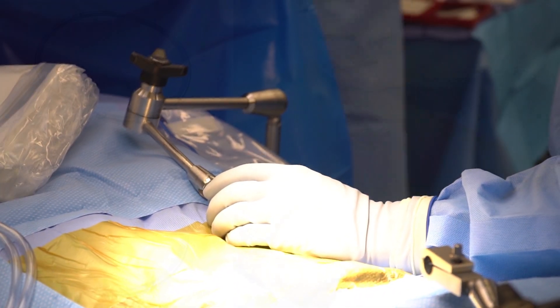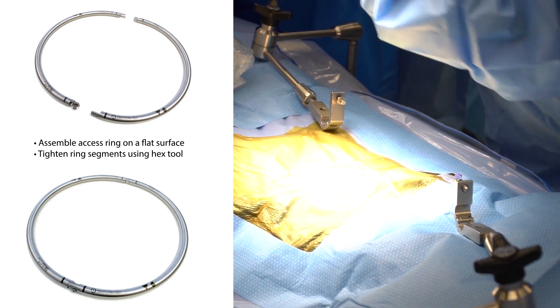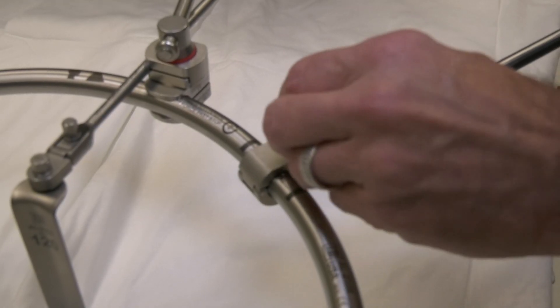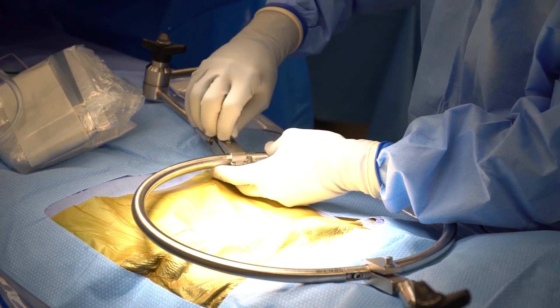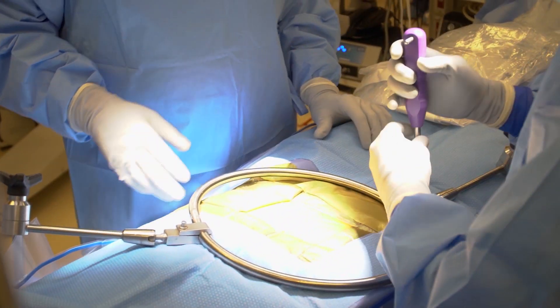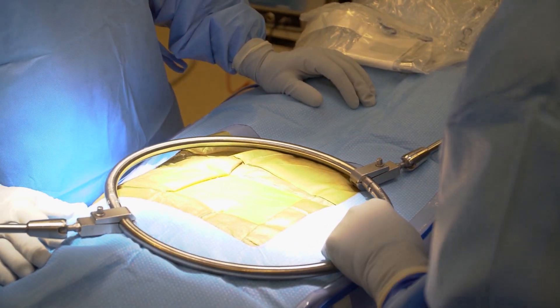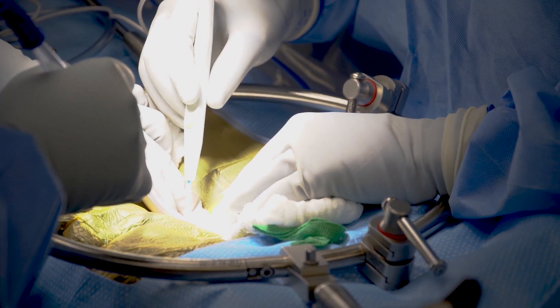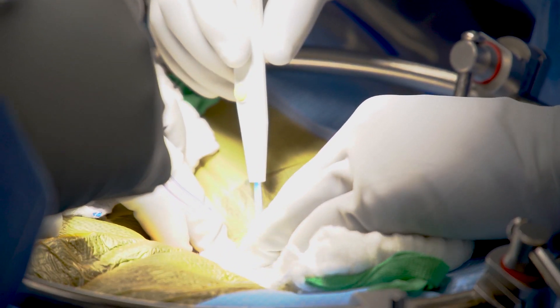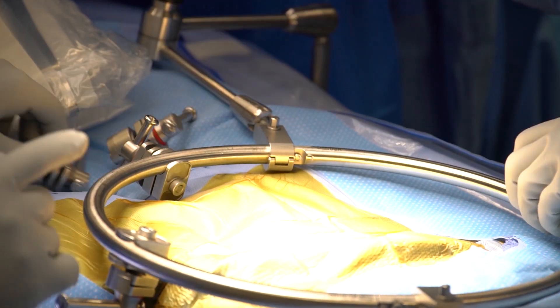Place it here at these areas where the marks are located. You can actually see the marks on the retractor system. It's good to hand screw these first, then take your retractor tightener — this is just a hand tighten. You want this as close to the patient as possible, and the incision that you're going to be performing needs to be in the middle of the exposure field.